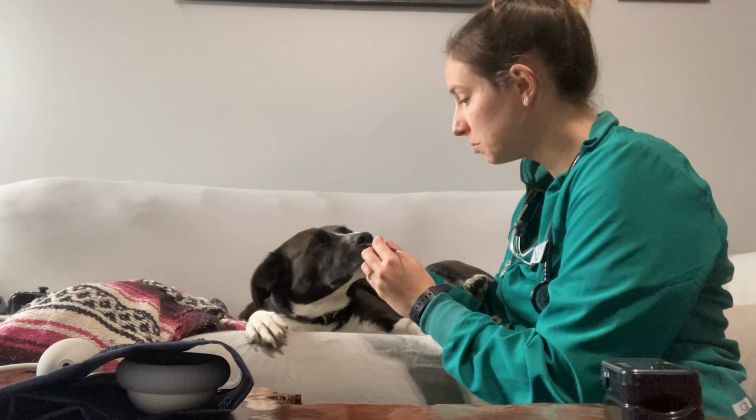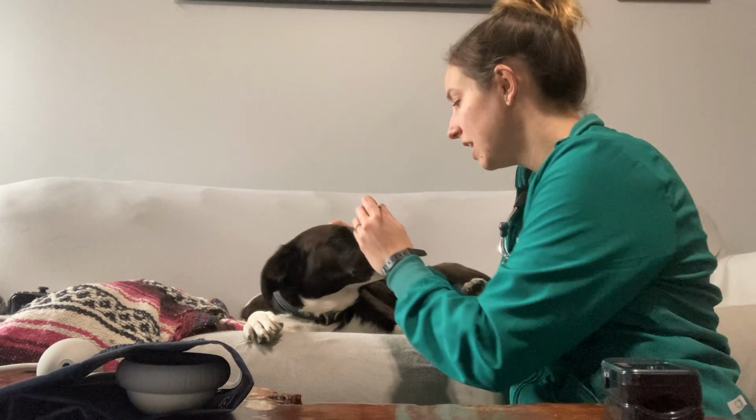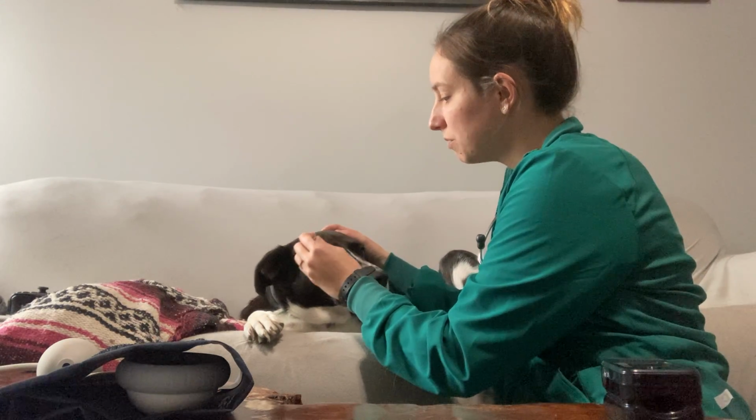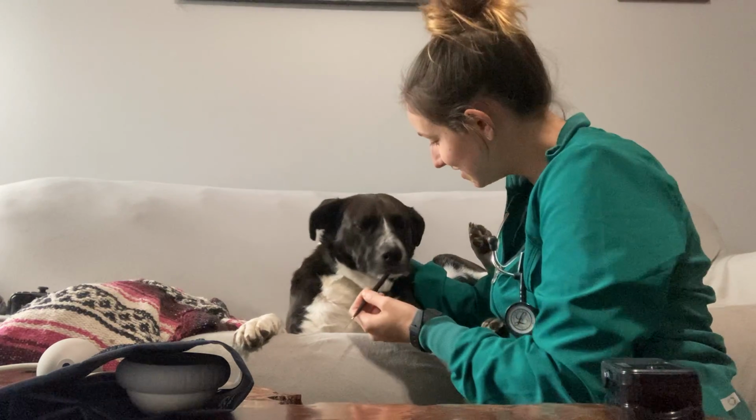There's the thermal scan of the forehead. Yes, sniff, sniff, sniff. Oh yes, does that taste good too? In the thermal scan, we would run it along the forehead, down the ear, and if they were sweaty, we would come behind the ear as well. You did so well, Sadie.